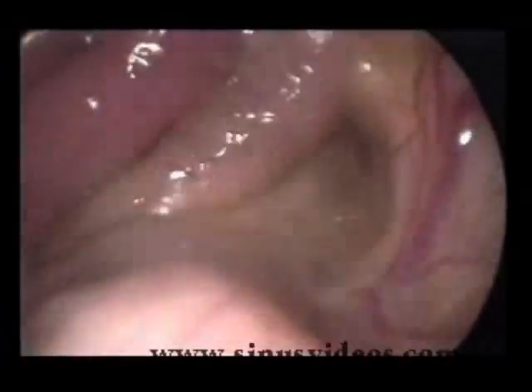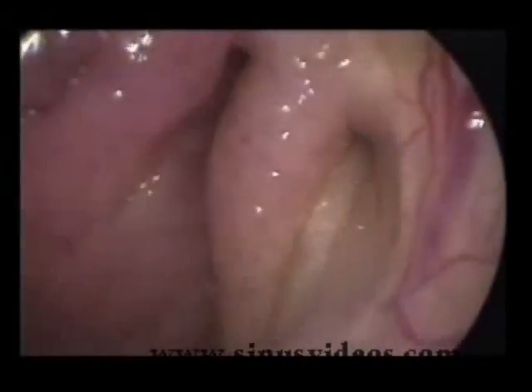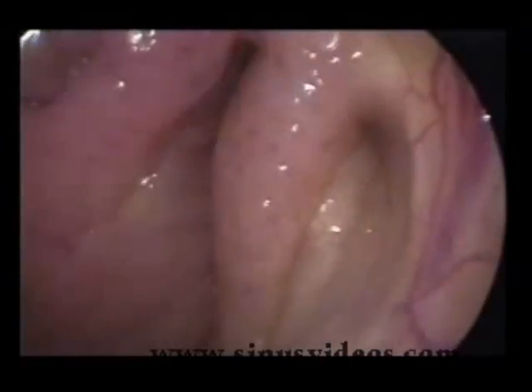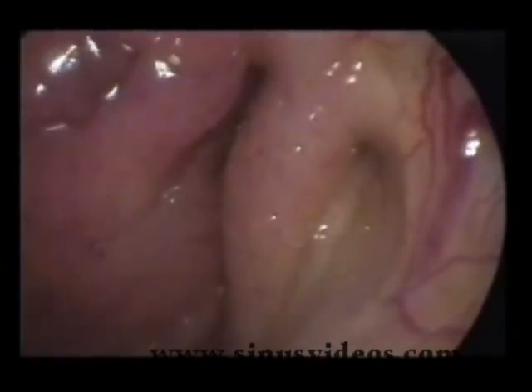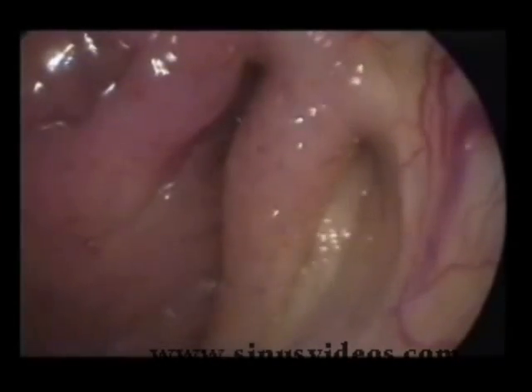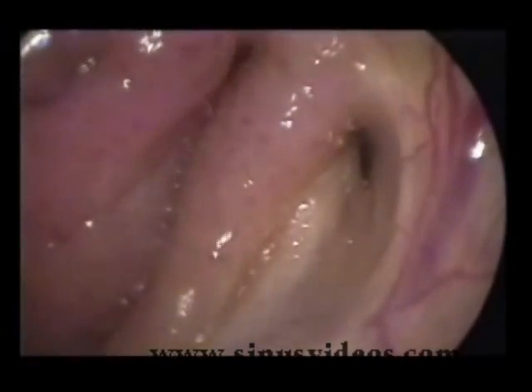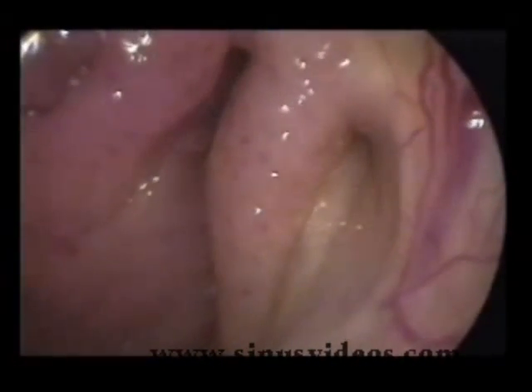This is a left eustachian tube with severe chronic otitis media, and there is an unusual double elevation of the palate and levator. Seen in slow motion, the first wave of the palate elevates and a second wave paradoxically closes the eustachian tube orifice at the time it should be dilating.